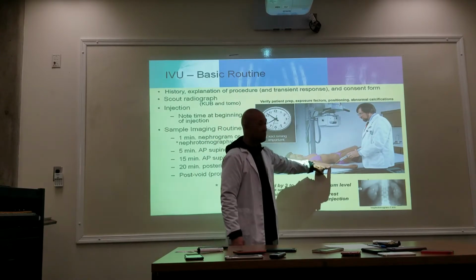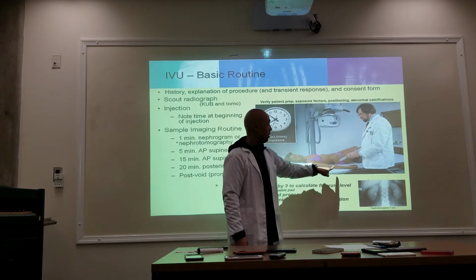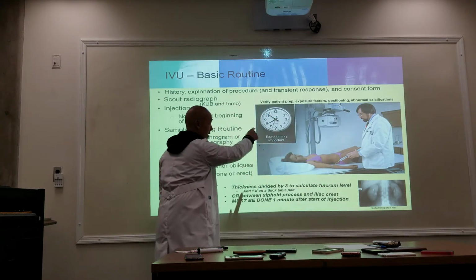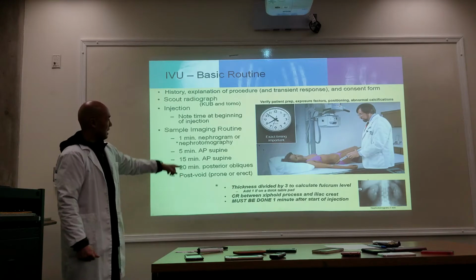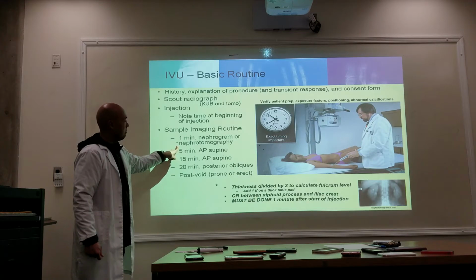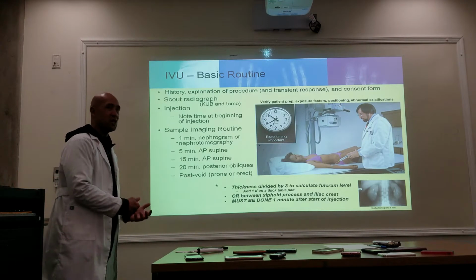And as you're injecting, you're also checking the site to make sure that there isn't any what? Extravasation, okay? So you're watching your patient for any type of response or reaction. And you also noted, because you're looking at the clock, the time you started the injection. Because the very first shot that you're going to take is this nephrotomogram. And it has to be done right here, 60 seconds right after your initial injection.